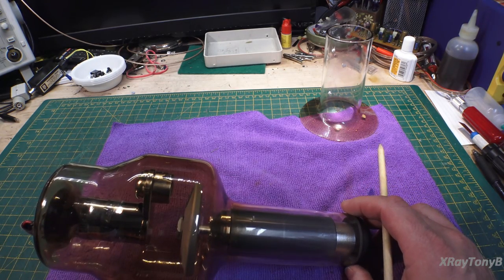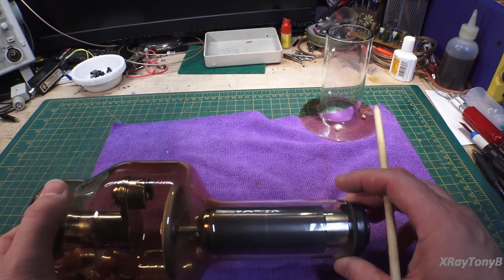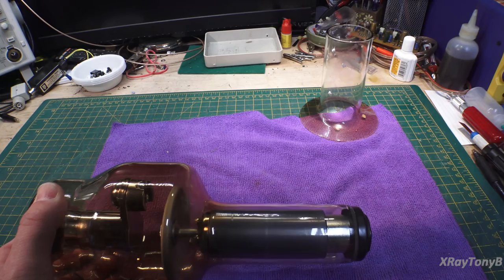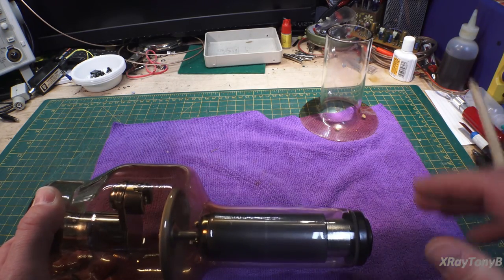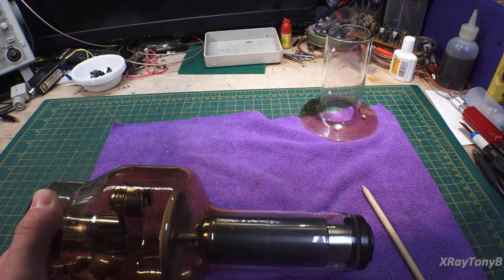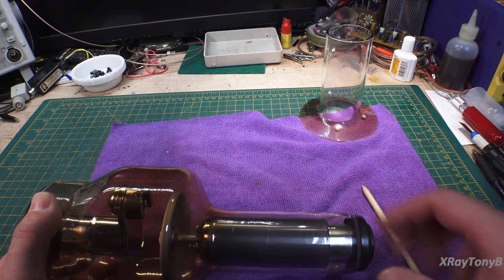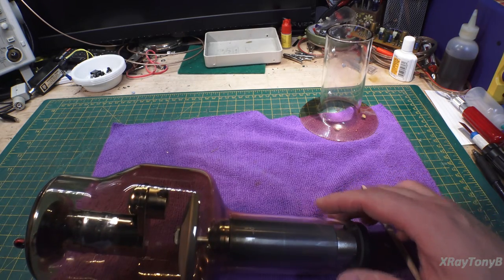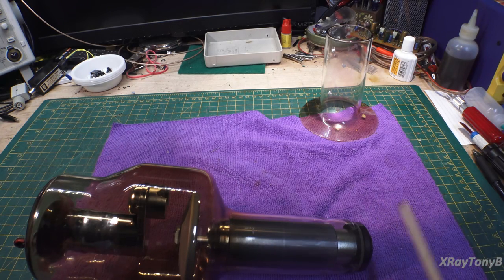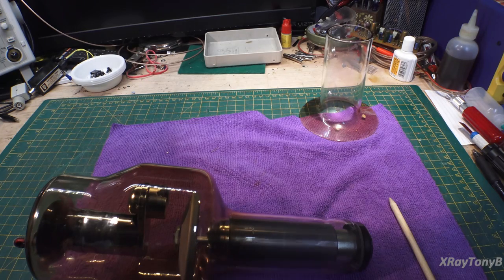So as you can see, I've seen these older tubes that had the really expensive lubricant in them. I've seen them coast once you get them spinning. If you shut the machine off, this rotor will coast for over a half an hour to an hour. Pretty amazing how good these bearings are. Now the later tubes, they quit using that high-end lubricant, and they don't coast quite as long. They maybe coast for 5 minutes or so, if that. But they still are very, very good compared to other bearings that you're used to seeing.